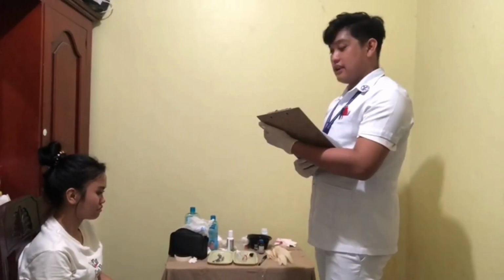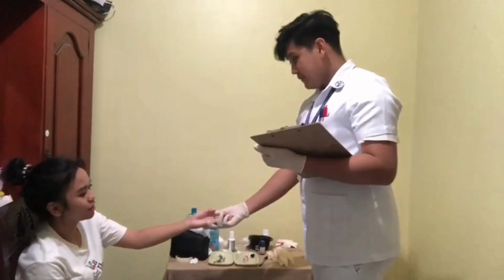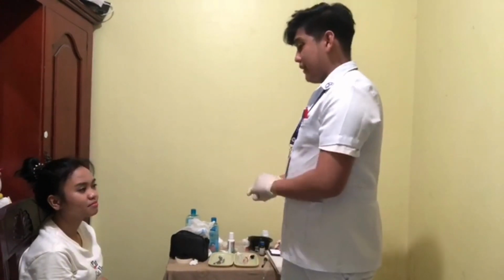Good day, ma'am. My name is Charles Axel Hester, your student nurse for today. May I know your name and your age, please? Christina, July 14, 2000. Okay, ma'am, thank you. At this moment we are going to do administering medication via subcutaneous route. We will inject insulin in this part of your abdomen. As you may know, insulin controls blood sugar since you have type 1 diabetes. You'll be experiencing pain. So next, we'll move to the site selection and inspection.